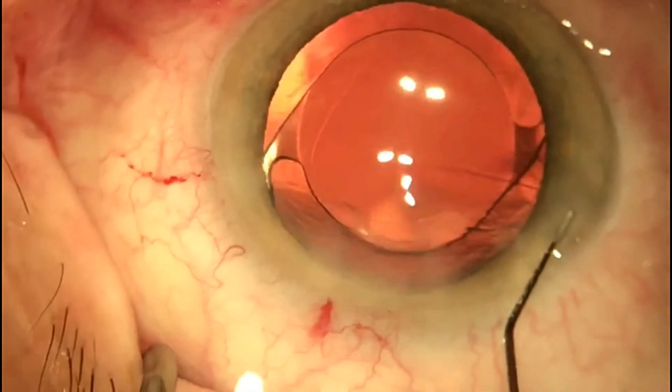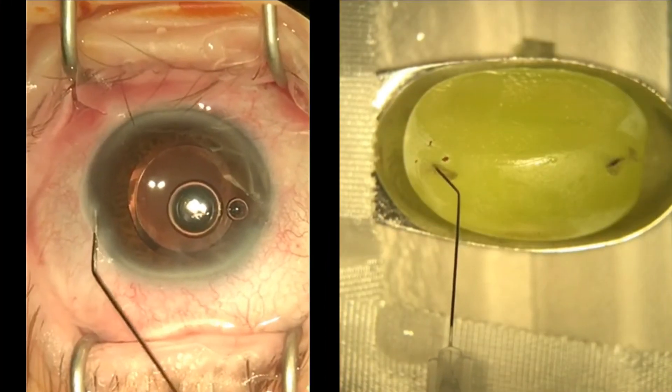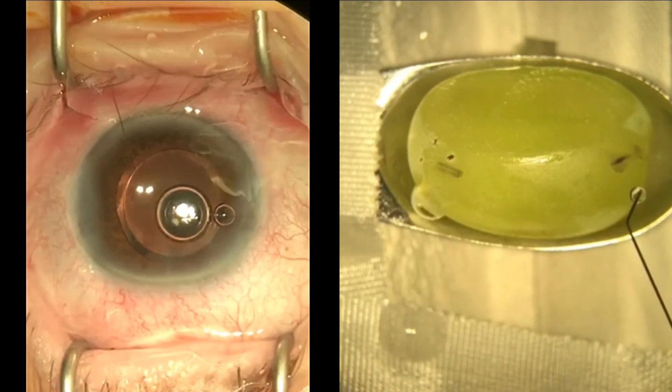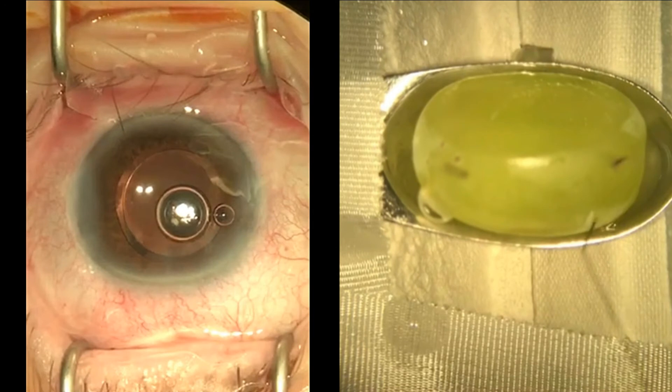The last step in cataract surgery is corneal hydration. Here we demonstrate the insertion of a primed cannula into the incision sites on the grape. It is important to ensure that the cannula is pointing in a direction parallel to a tangent at the limbus to minimise the risk of the cannula dislodging into the globe.